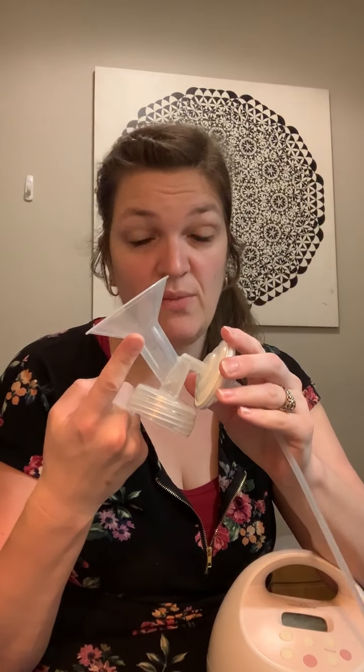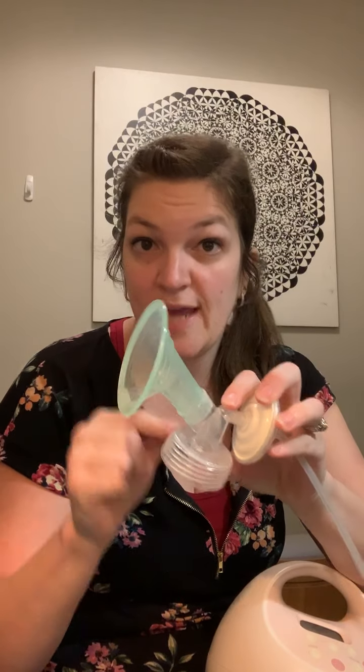Now again, this is the Spectra piece, this flange is what came with the pump. Pumpin' Pal does make a flange adapter for the Spectra, okay, so that you can put that on. Now if you really wanted to, you could get the Pumpin' Pal adapter and then put a Medela flange or a Hygeia flange or a Maymom. There's a bunch of different pump flanges to make a more comfortable fit. Lactec has a baby motion flange, which is another alternative. So you could technically jerry-rig and find the perfect flange fit by getting the Spectra adapter piece from Pumpin' Pal.